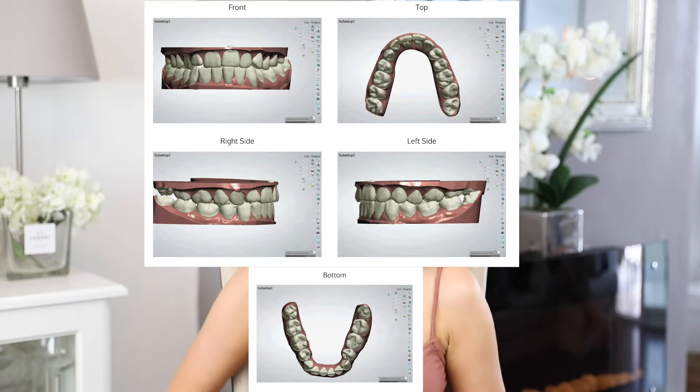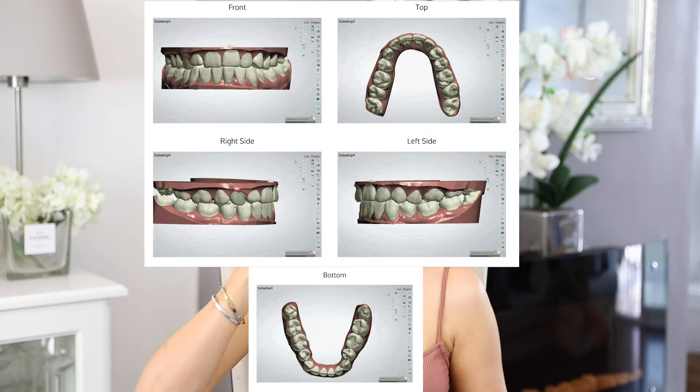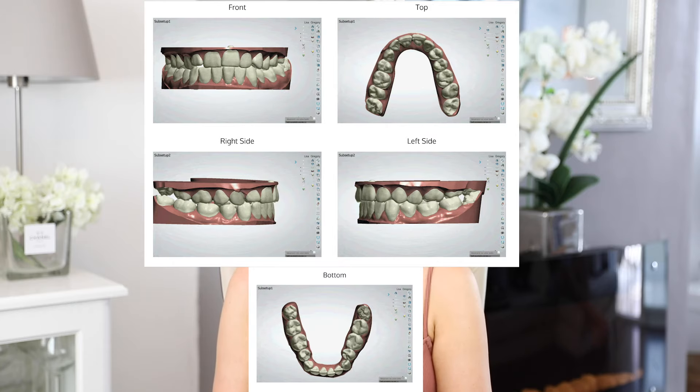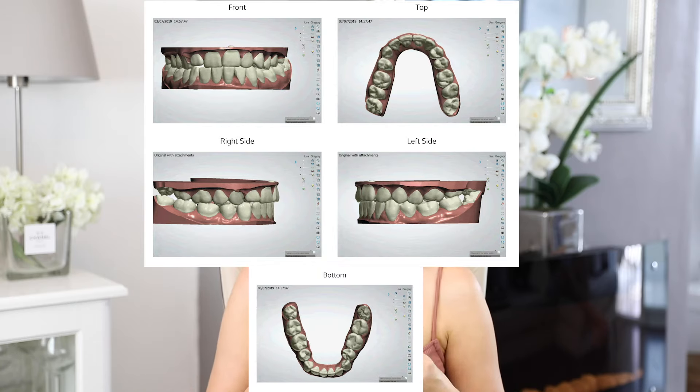Before this package arrived, I had to approve the treatment plan, which was fantastic to see. They sent me through a treatment plan with videos showing exactly where my teeth would move into. If I was happy with it I just had to let them know and they would continue making them; if I wasn't, we would discuss further and adjust from there.